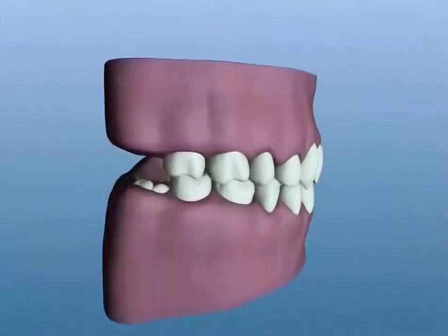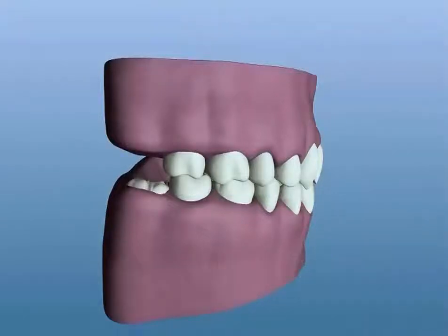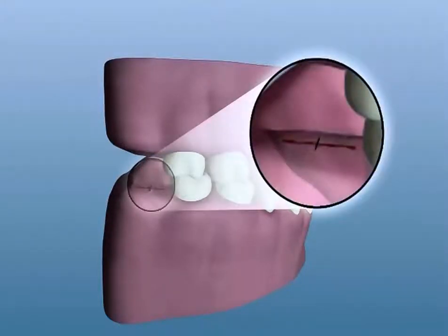During the typical removal of wisdom teeth, the oral surgeon makes an incision in the gum overlying the third molar, or the wisdom tooth, allowing it to be exposed. A small amount of the thin jawbone that covers the impacted tooth may need to be removed to complete the exposure. When the tooth is clearly exposed, we remove it, sometimes in 2 or more pieces. After removing the tooth, we rinse and examine the area and usually place 1 or more stitches. After surgery, patients are allowed to rest until we feel they are ready to be released.